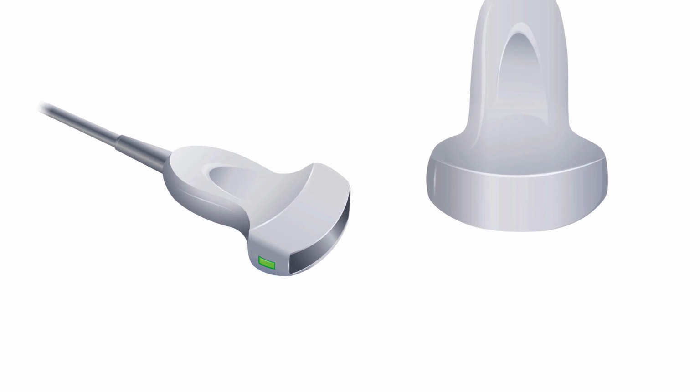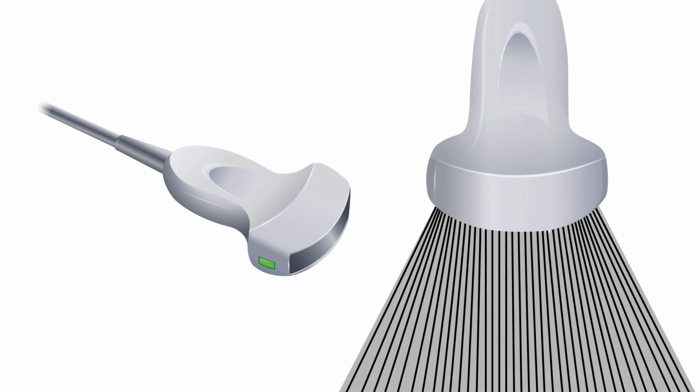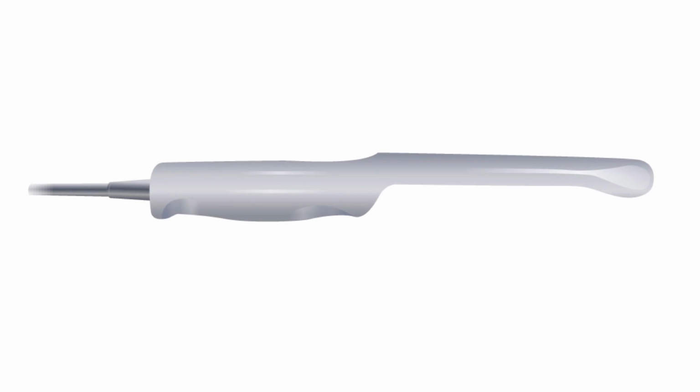A curved array is a linear array that has been slightly curved. You can see that the beam splays out, giving you a wider field in the deeper portion of the image, but the sound beams are located closer together and nearer to the probe. An endocavitary probe or intracavitary probe is merely a curved array with a very tight curve on a longer handle.